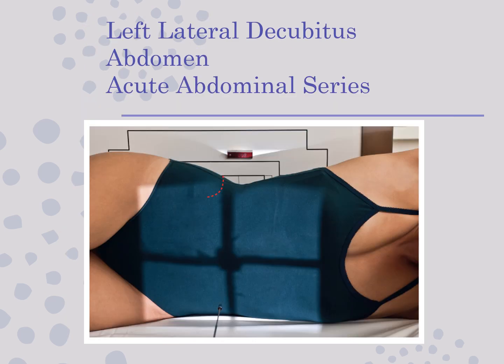The left lateral decubitus is done in place of the upright abdomen if the patient is non-ambulatory. And we discussed that this central ray is visualized incorrectly. It should be 2 inches above iliac crest at midline. And this would be a left lateral decubitus, but we would use a right marker. And the technique on that is 80 at 12.5 on the left lateral decubitus.